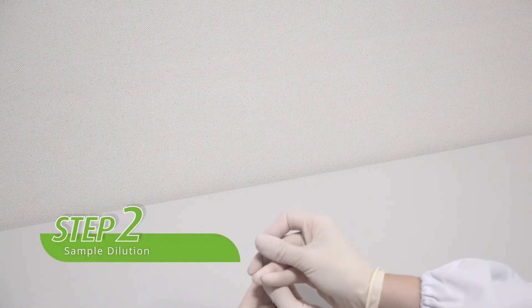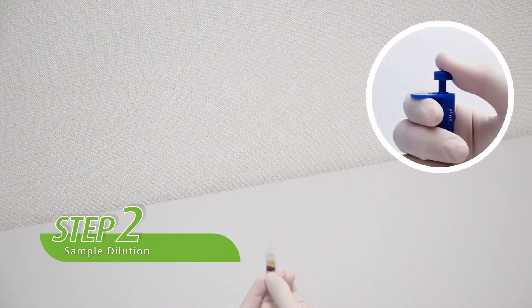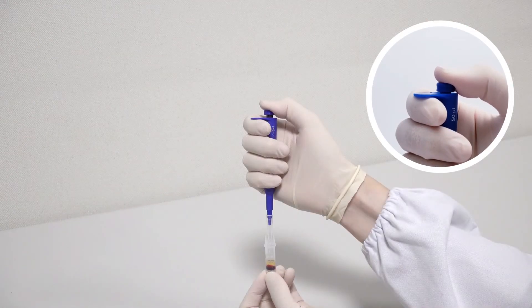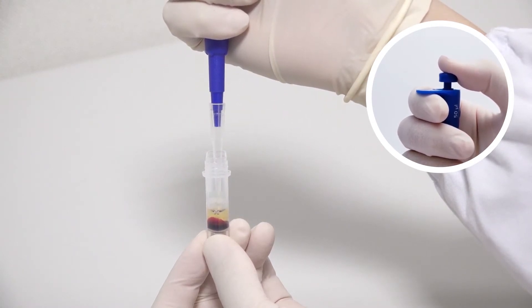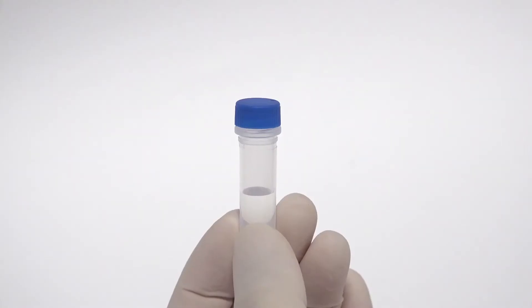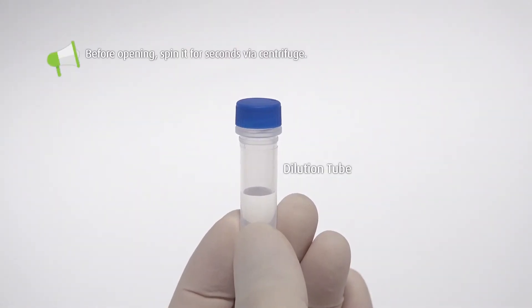Step two: prepare the diluted sample. Use a pipette to draw 50 microliters of sample from the collection tube. The sample should be taken from the clear portion of the centrifuged sample. Before opening the dilution tube, please spin it for several seconds via centrifuge to avoid liquid loss on the cap.